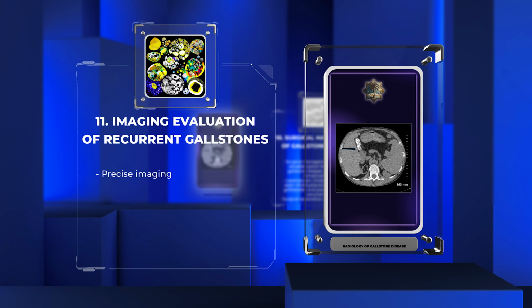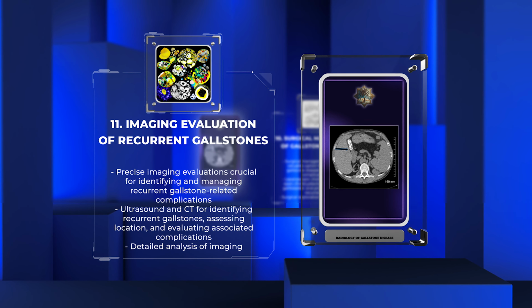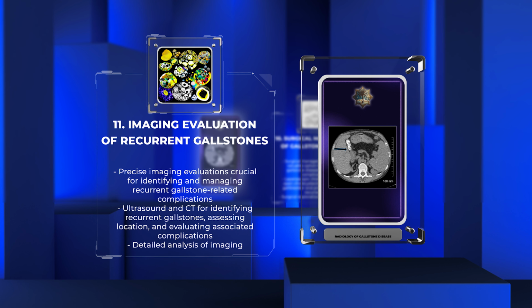Professor, despite surgical interventions, patients may experience recurrent gallstone-related complications. Precise imaging evaluations play a crucial role in identifying and managing these recurrences. The professor showcases various imaging modalities used for identifying recurrent gallstones, such as ultrasound and CT.